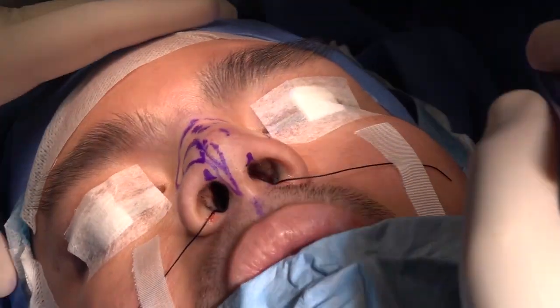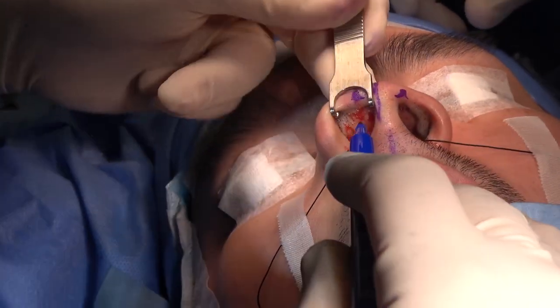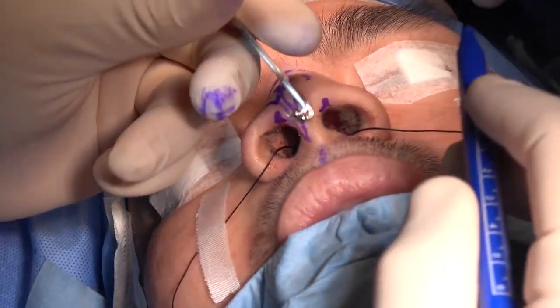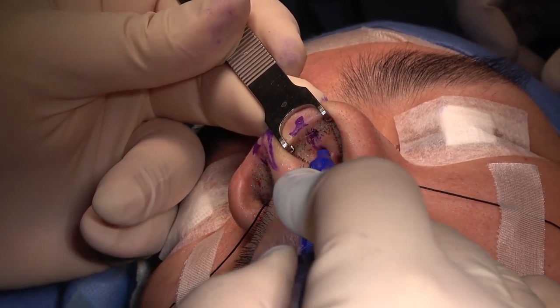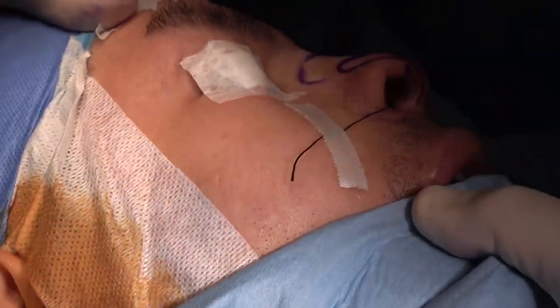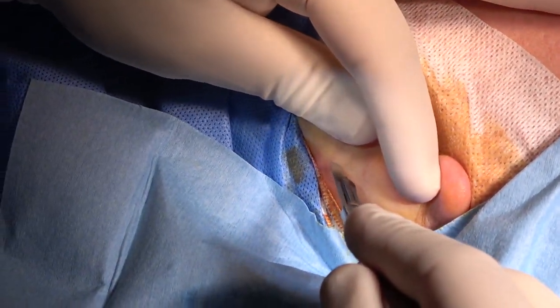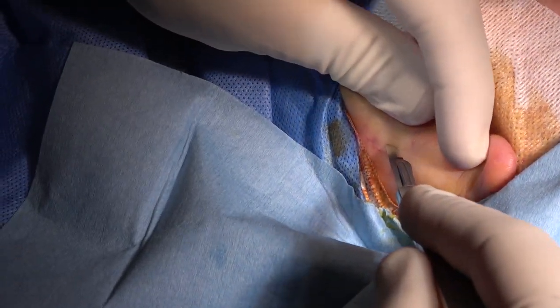Now the first step is to also continue marking from inside the junction of the intermediate to the lateral crus. And before I start, I'm going to obtain a conchal graft. I need autografting for this patient. So it goes through a skin crease, as you see.